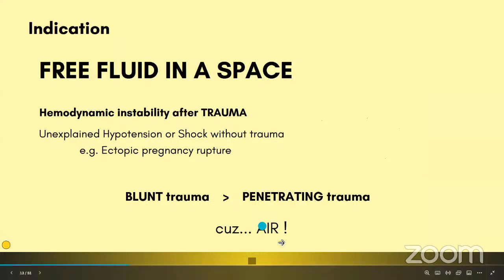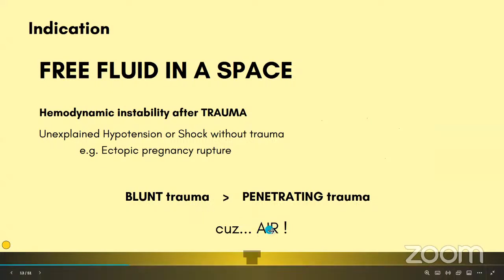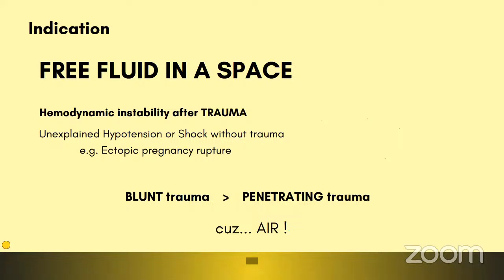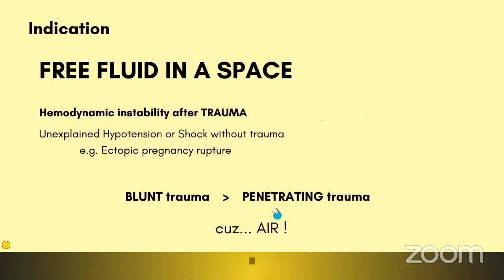The main reason is air. As I said earlier, while dealing with artifacts, sound waves travel much slower in air compared to fluids and solids, so the attenuation is much more rapid. Hence, we get shadowing. We won't be able to appreciate the organs better if we are dealing with air just above the organs, let's say in case of pneumothorax. Got it?